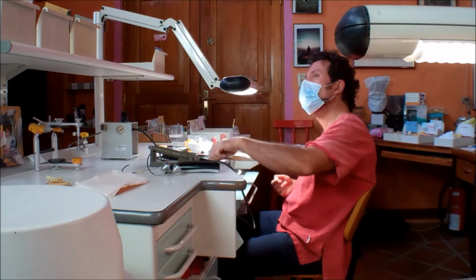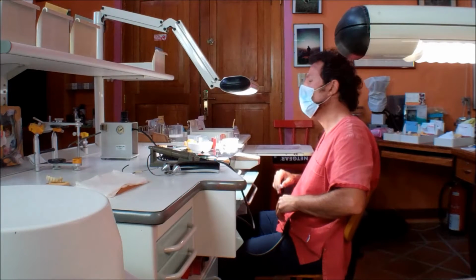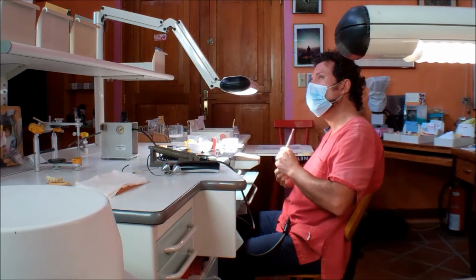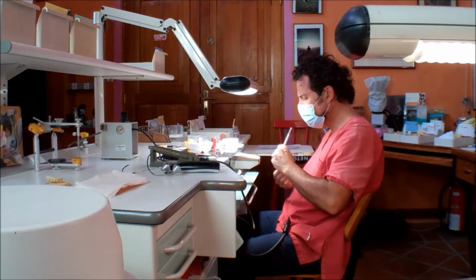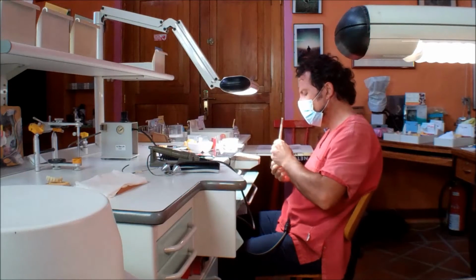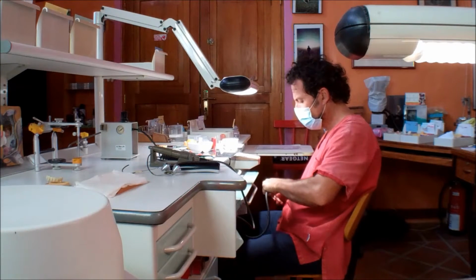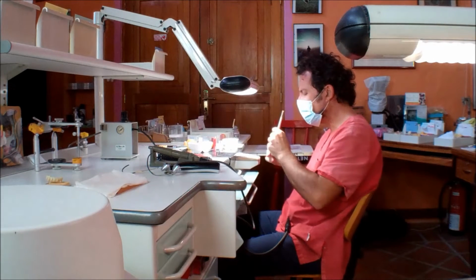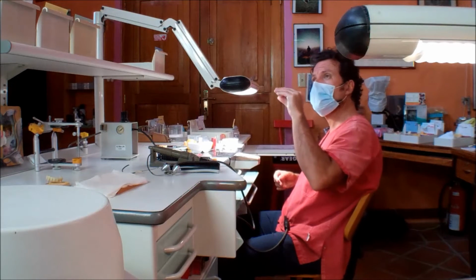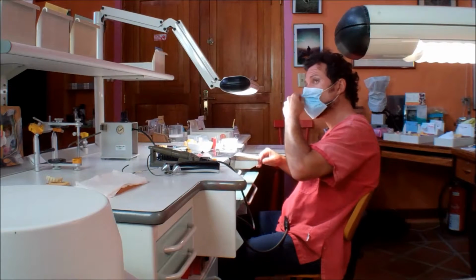And one of the things I heard about zirconia is it may not be as aesthetic looking for the front teeth, but then learning about this that you do here, it can be just as good looking, just as aesthetic. No, this is because when you use only zirconia, the crown is 100% zirconia, but in your case, it's different because we're going to have zirconia exactly where the function is: occlusion, lateral, protrusive of the mouth. From that point up is going to be porcelain, so it's the aesthetic part.